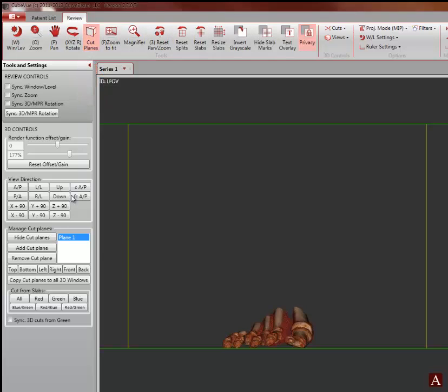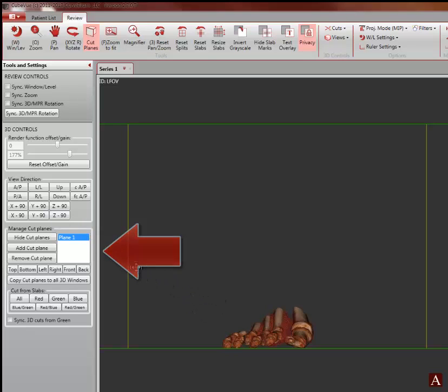Notice this will do two things. It will enable the manage cut planes controls on the toolbar and it will insert a cut plane. The system default is to insert a cut plane in the center of the volume from the back.